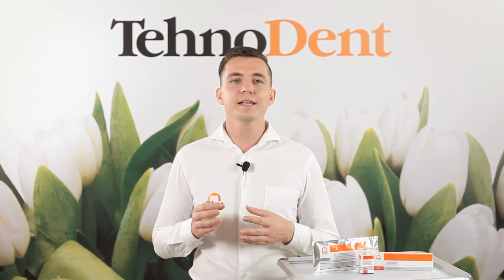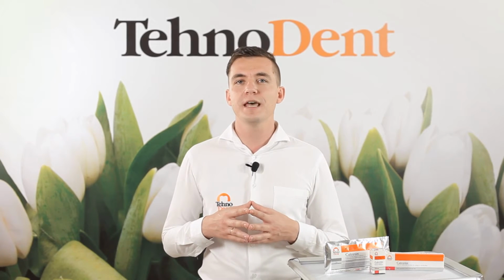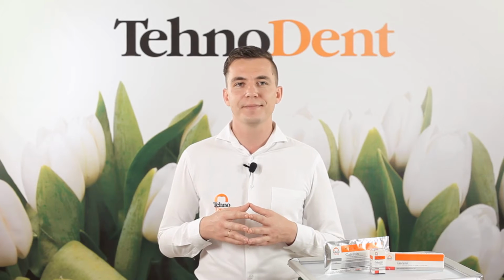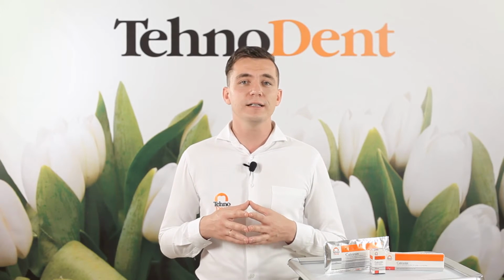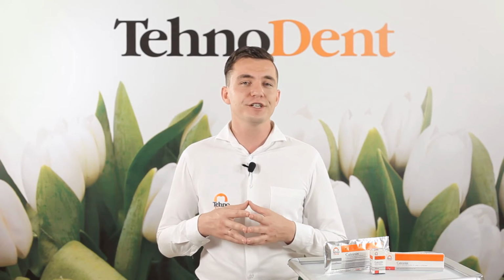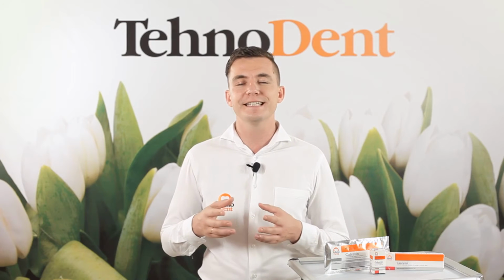Paste should be isolated with a dry cotton swab, and the tooth is covered with a temporary filling cement for a period of 7–10 days. Depending on the result, continue treatment with the change of the material to a fresh portion or apply the final filling of the root canal with the sealer.